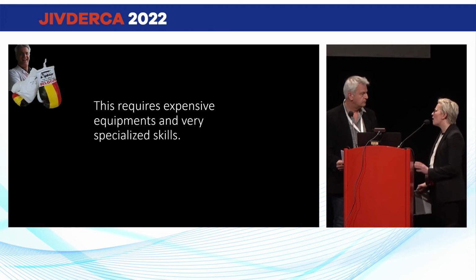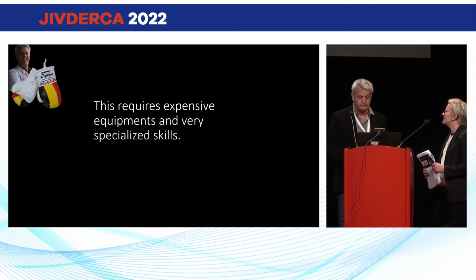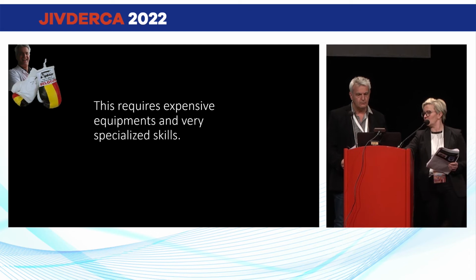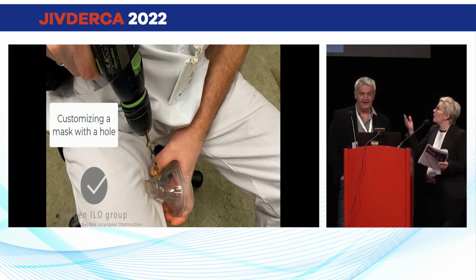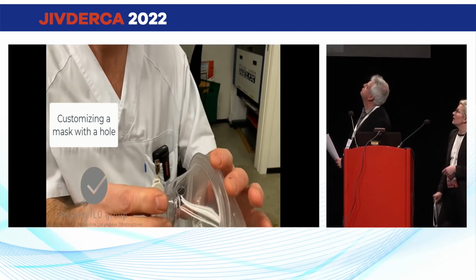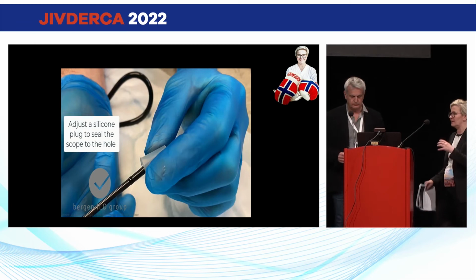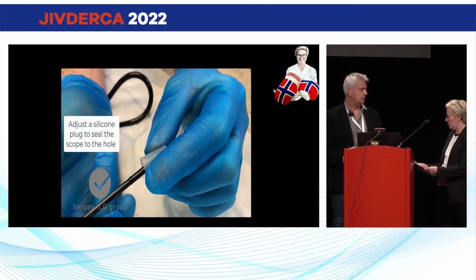Yes. Now we are at the point in our discussion where I agree to stop this discussion, because this equipment is already in the hospitals, in several departments. And of course, we need some help to start with these examinations, and we get help from our technicians. We use the masks, we use the scopes we have. They had silicone plugs we could adjust to the scope, so we get sealed masks during the examination. And it's not that difficult.